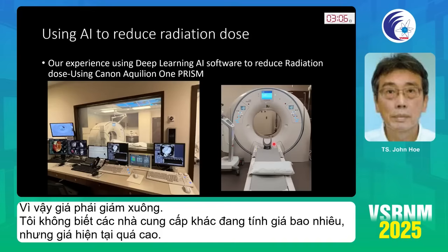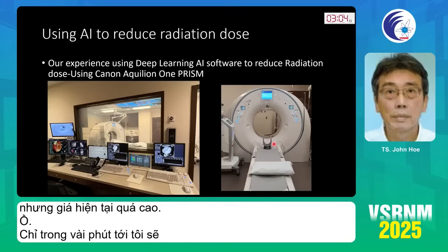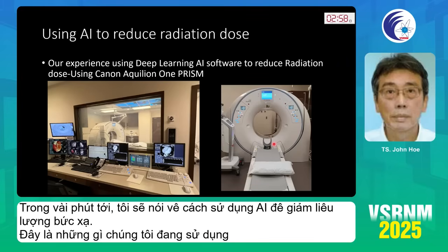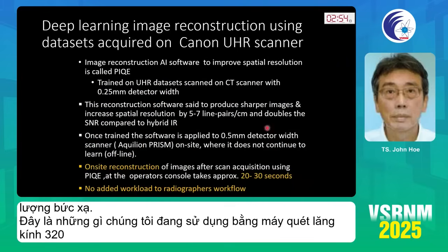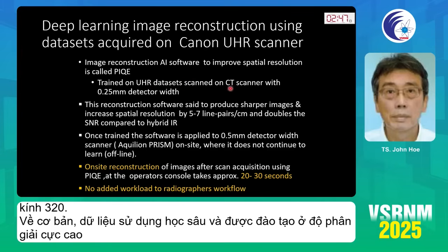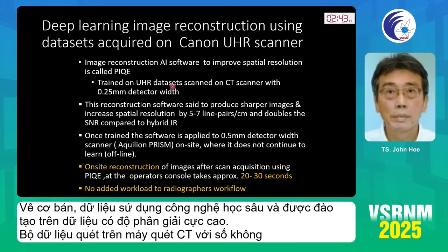Now, in the next few minutes, I'll talk about how to use AI to reduce radiation dose. This is what we're using, a 320 PRISM scanner. Basically, the software uses deep learning and is trained on an ultra high resolution data set scanned on a CT scanner with 0.25 detector width.